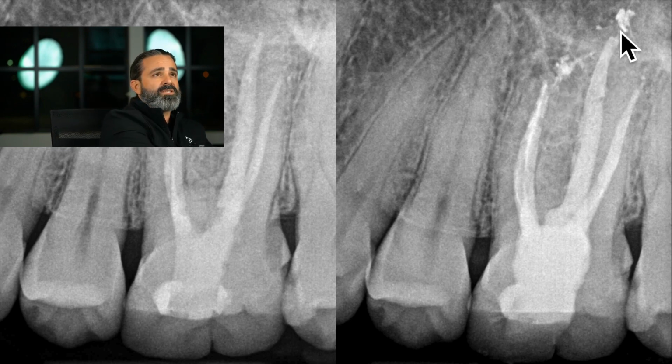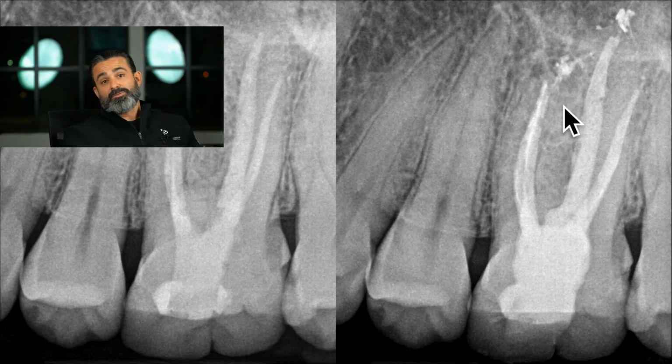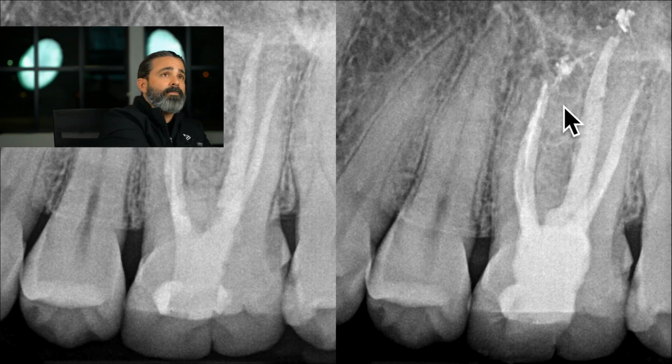And as I continue to study, I see some uniqueness both to the palatal and to the distal buccal, but primarily this was my goal. So time will tell how true that is. I do know I filled something. I believe I cleaned it, and I say that for you naysayers out there, but I do believe it is cleaning as we're taught and as I've witnessed throughout my practice with this technology. And so, to be continued for this recall.